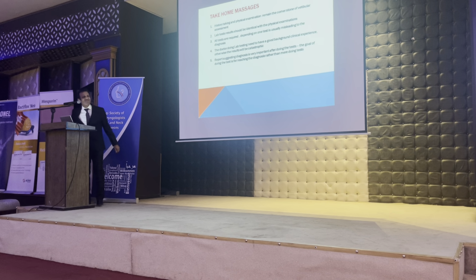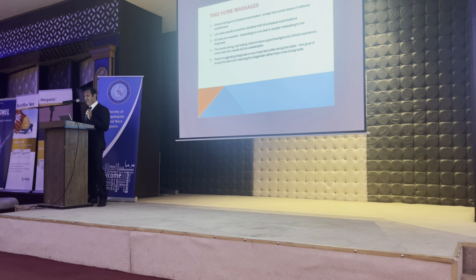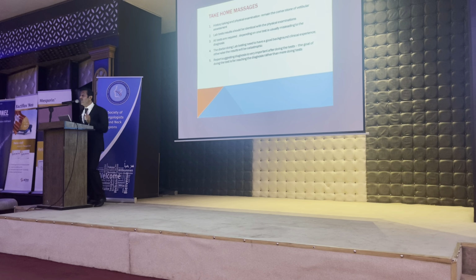Take home messages. It is less than 10 minutes. History taking and physical examination remain the cornerstone of vestibular assessment. Laboratory testing results should be identical with physical examination.